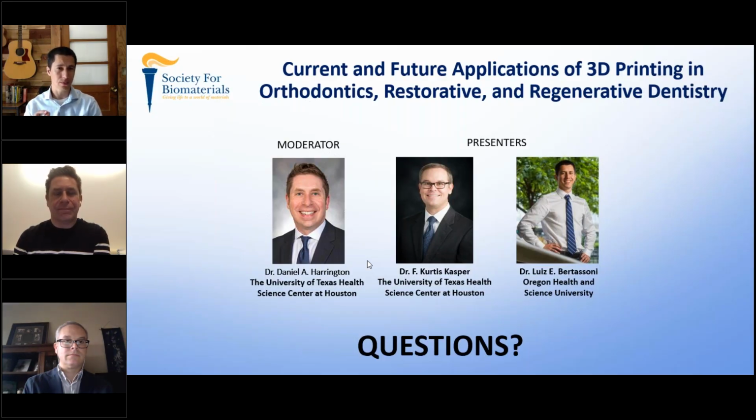And I think that's really where you find key differences between other types of ceramic printing processes out there and Lithoz's proprietary process. And full disclosure, I have nothing to do with Lithoz. I don't get anything from them. Much the opposite, I actually pay them to print stuff for us. But I think the technology that they developed several years ago enables high precision of printing, high density, very high mechanical properties. And I think that's going to find its way into the dental market fairly quickly, and it's probably going to change a whole lot of things for what we do, especially in the prosthodontics field.